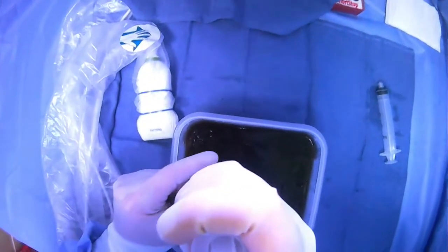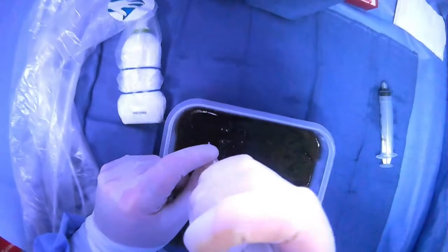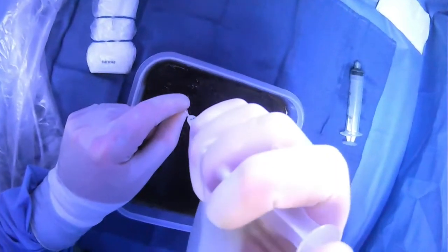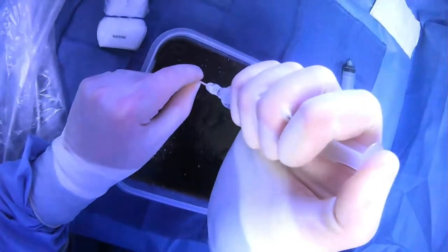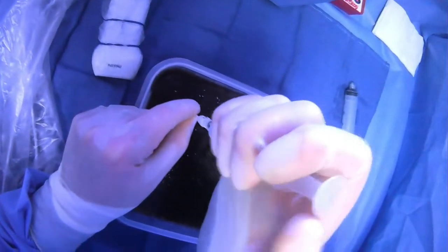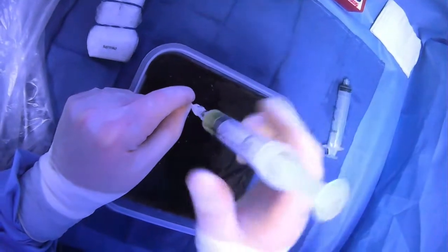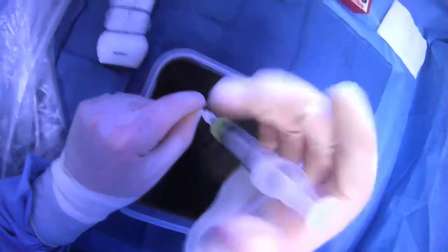We're going to go where we've marked before, where we know we need to go, and then we're just going to go in and start giving lidocaine as we go. Then we'll go a little bit deeper and start aspirating — and here we see we've already hit into the ascites collection right there. We're aspirating back ascites.